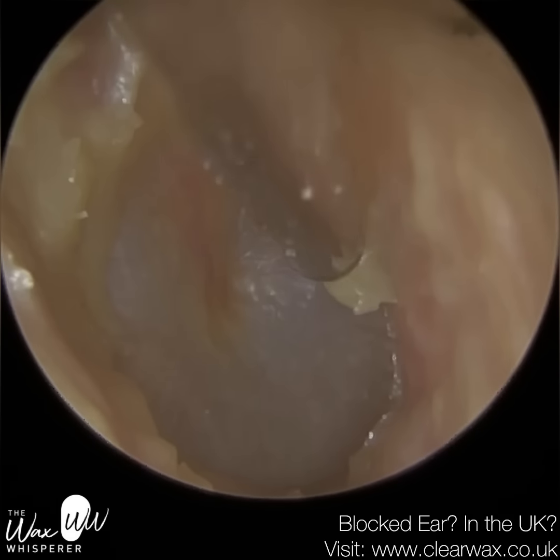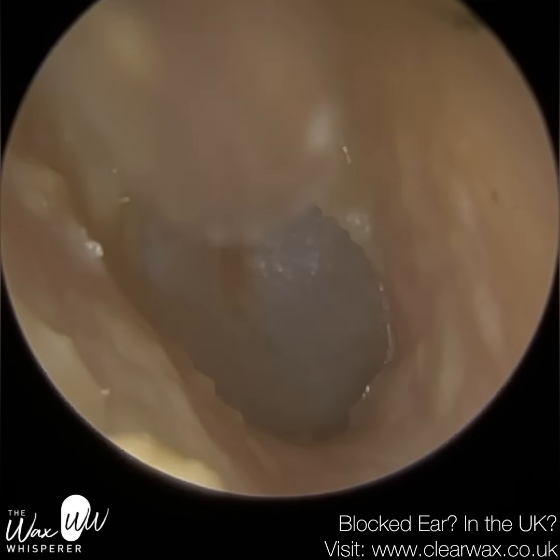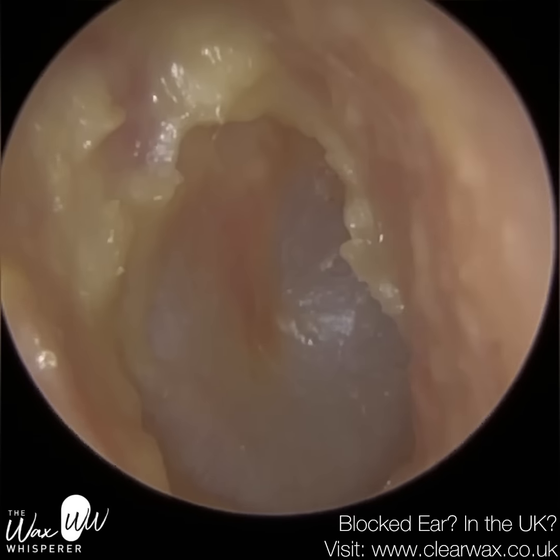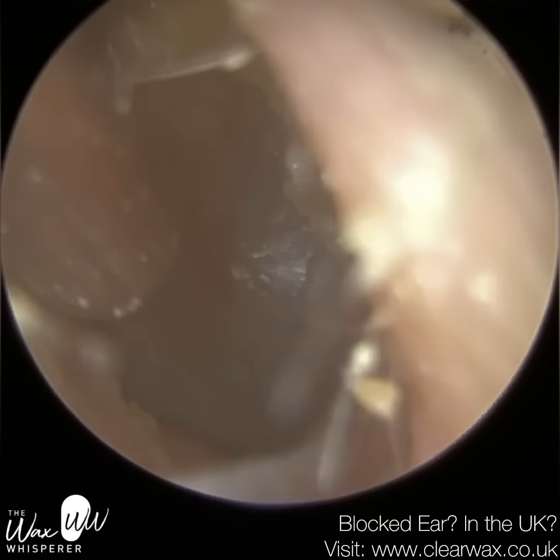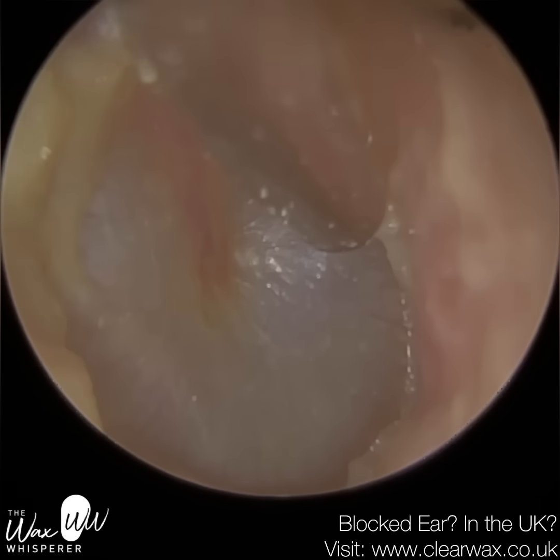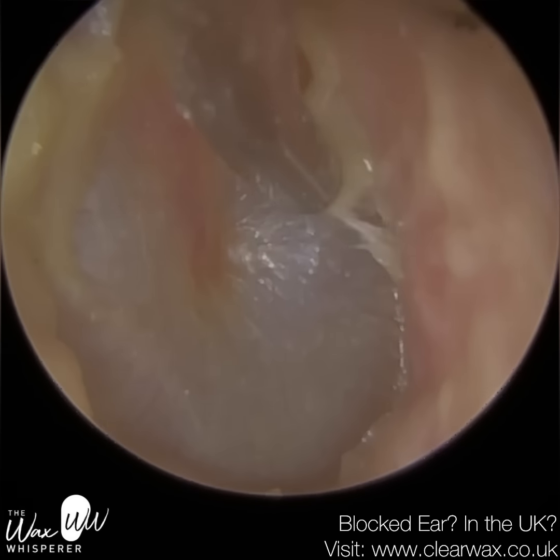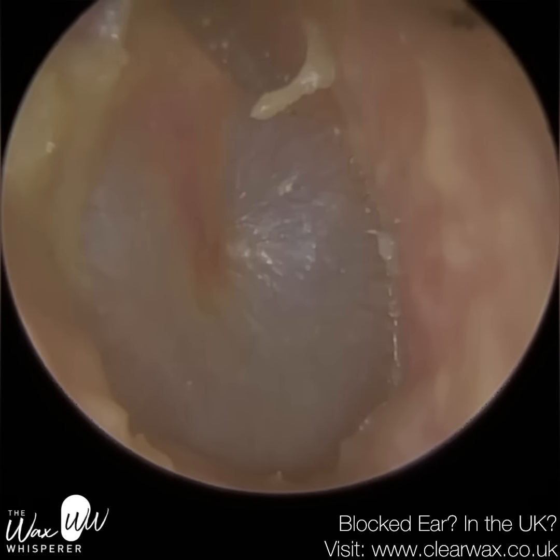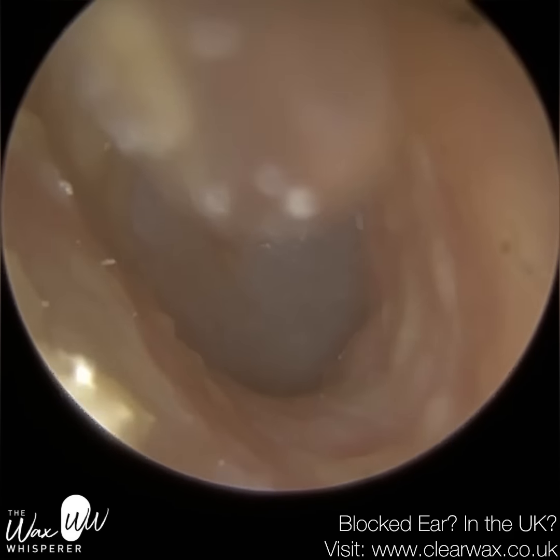I've actually advised the patient against olive oil to help moisturise the skin naturally, because there is evidence that, or when I say there's evidence, I've read an article written by an ENT doctor who advised that olive oil can actually make a fungal infection far worse, because the fungi can actually feed on it. And as such, I've just taken that advice on board. So we're just mopping up around the edge with the fine end.